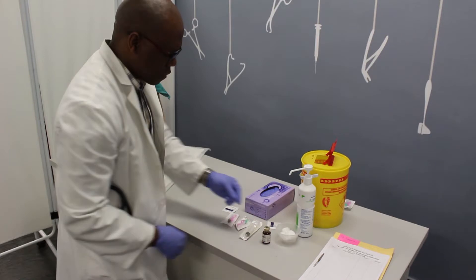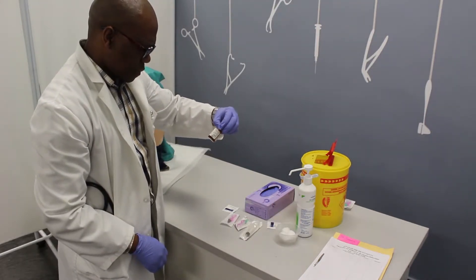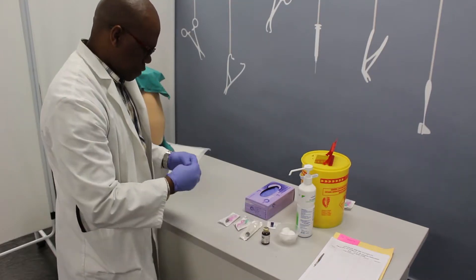Check the medication for the expiry date. Clean the top of the vial with the alcohol swab.